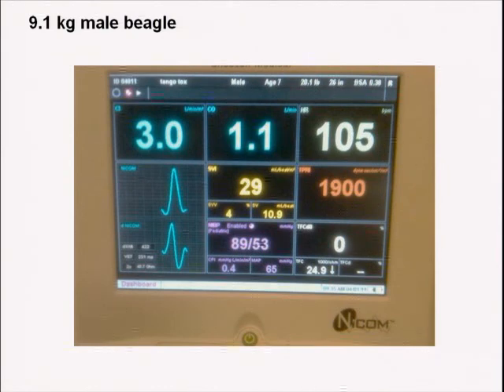As part of what goes on in my laboratory, we do a lot of subcontract work where we describe cardiovascular side effects of novel molecules. In doing so, we use a lot of open chest and other instrumentation. We also do a surgical preparation in this, and once I got the initial box, which if you haven't seen it is a simple little light device, it measures non-invasive blood pressure, it gives you an EKG trace, and as a side effect, it also gives you the flow. We started using it in some of these drug development protocols simply as an intraoperative monitoring device.